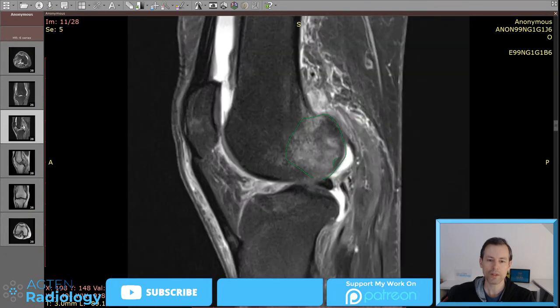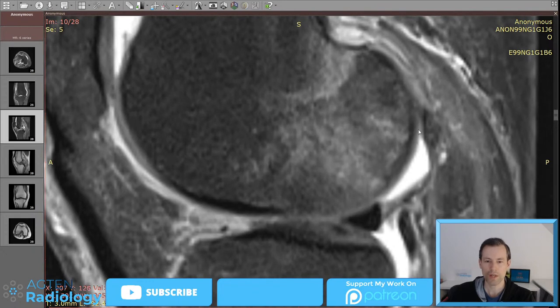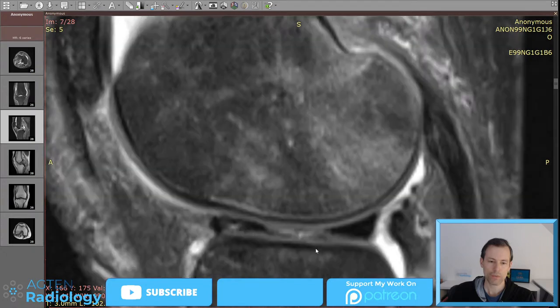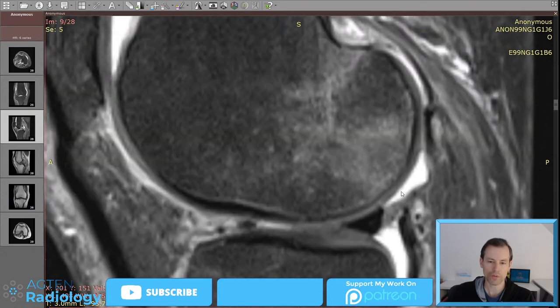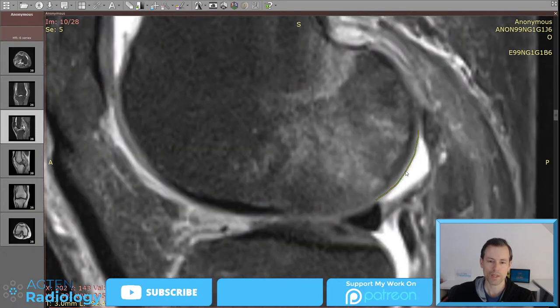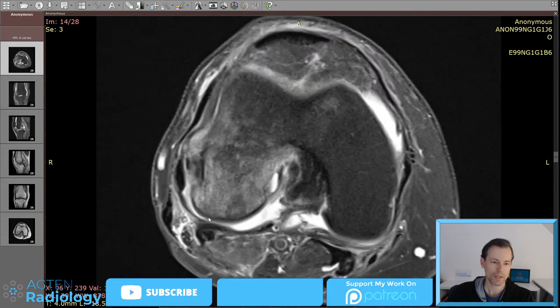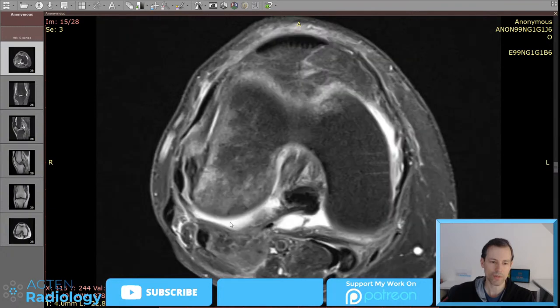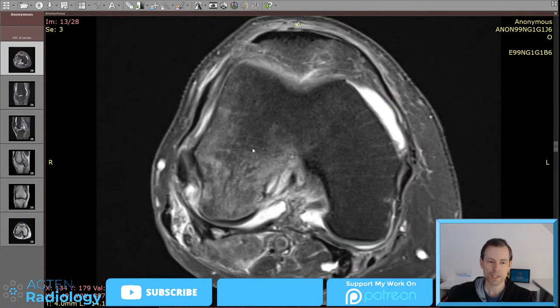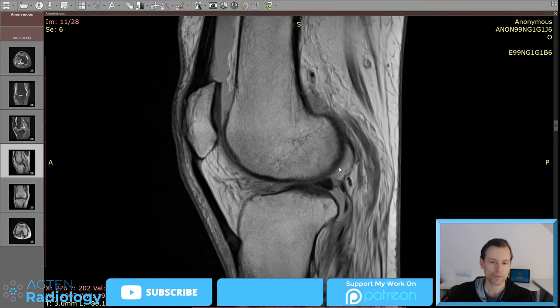And then the difference between a subchondral insufficiency fracture and an osteochondral lesion is that the cartilage is typically not really affected in a subchondral insufficiency fracture. And we can try to see this here. The cartilage is quite smooth. The patient is old, but cartilage is not too bad in general. It's not like we have large chunks of cartilage missing. You can also check maybe here, we don't see any fissures. We don't have subchondral cysts, etc. It's really just this very, very subtle subchondral line, or this kind of irregularity here.